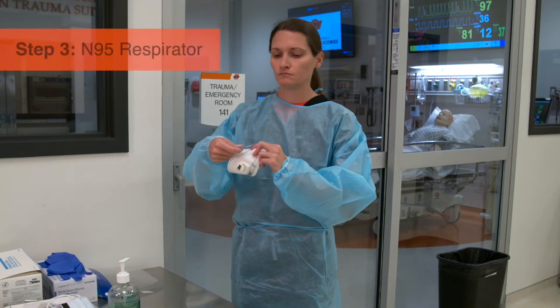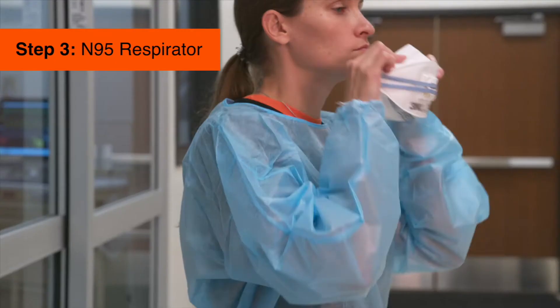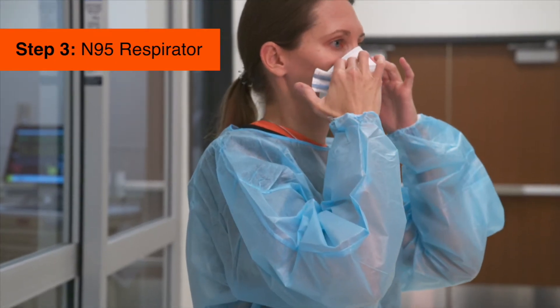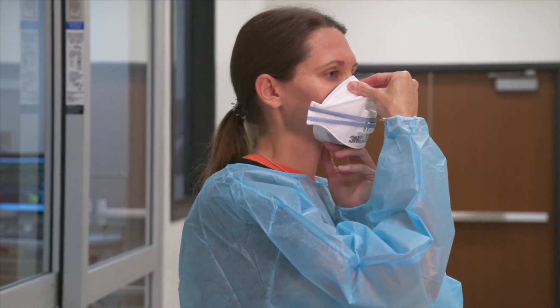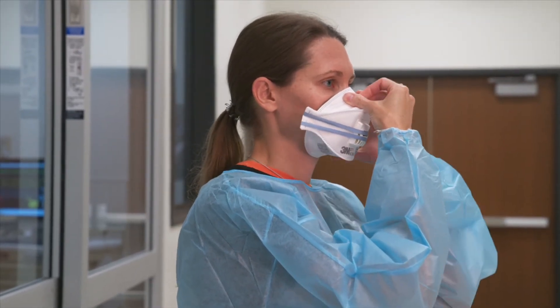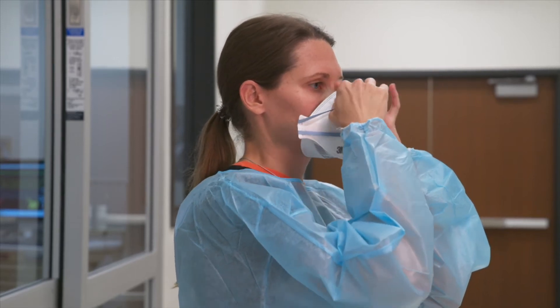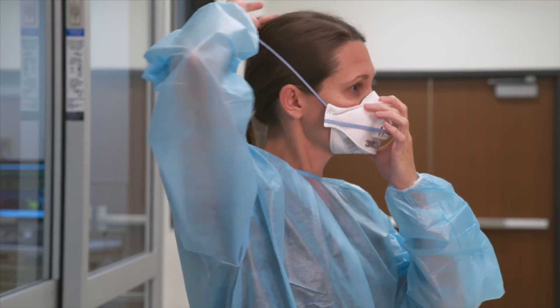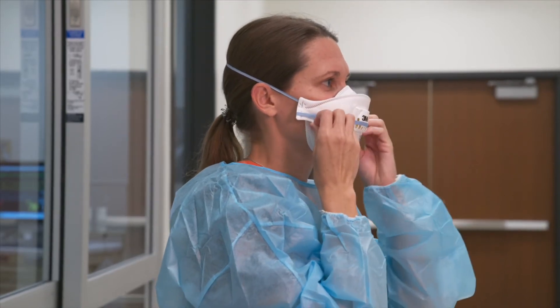You're now ready for the N95 respirator. When using a respirator with a nose piece, fit it to your nose using both hands — do not bend or tent the respirator. Extend the respirator under your chin, protecting both your mouth and nose. Pull the top strap over your head, placing it on the crown. Then pull the bottom strap over your head, placing it at the base of your neck.